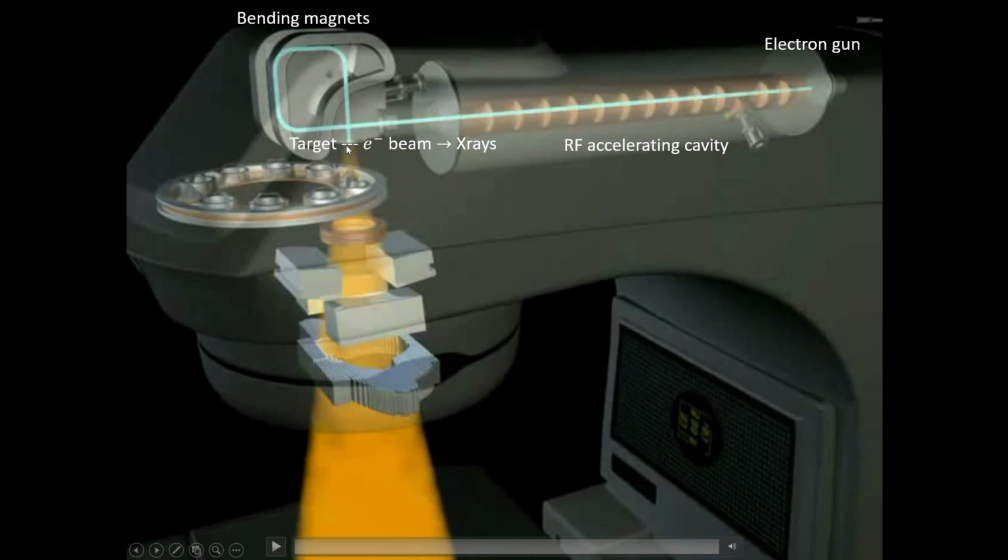And usually we don't treat patients with electron beams but with X-rays, and for that we need a kind of device to transform the beam, and this is just a target. Due to Bremsstrahlung, the electron beam will give birth to X-rays, and those X-rays will be sent to the patient, and there is an important device we will comment on later, which is the monitoring ion chamber.